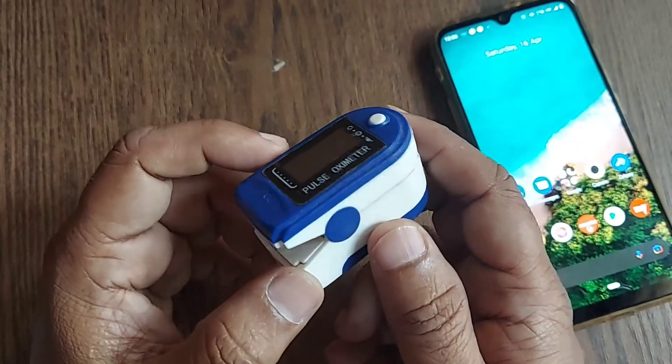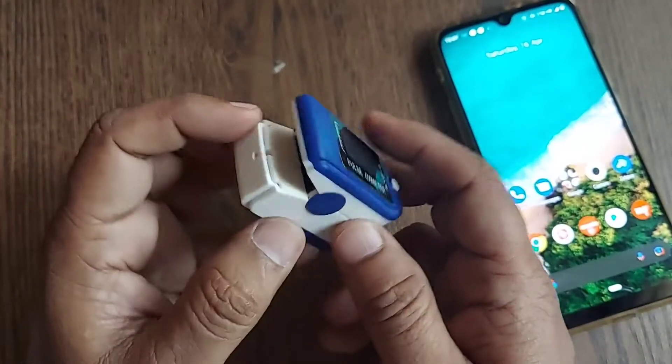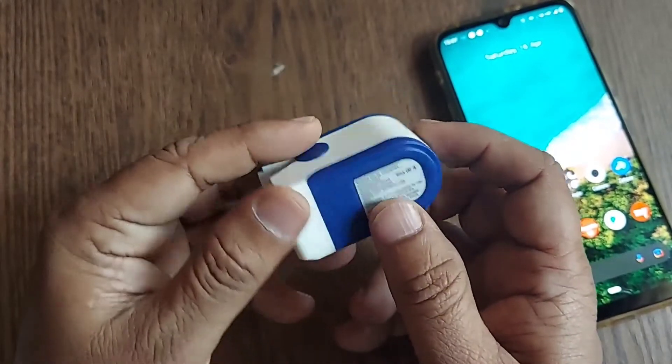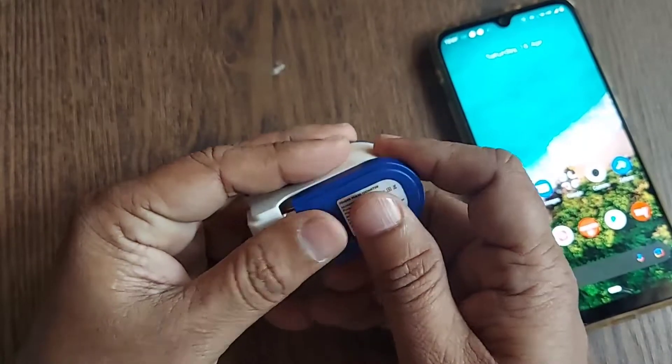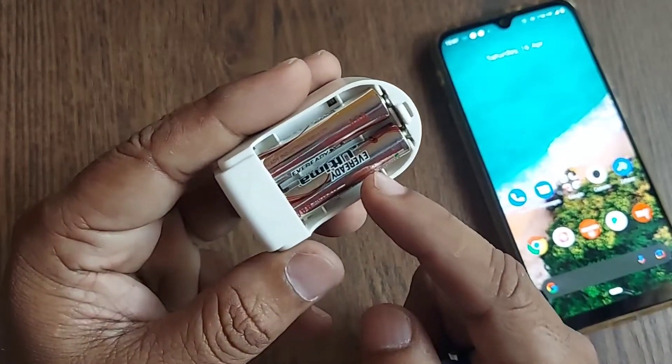When we measure through this device, this is basically the smallest device which runs on two AAA batteries. This is the front side and if you turn it, this is the back side. It has to be powered with two AAA batteries.